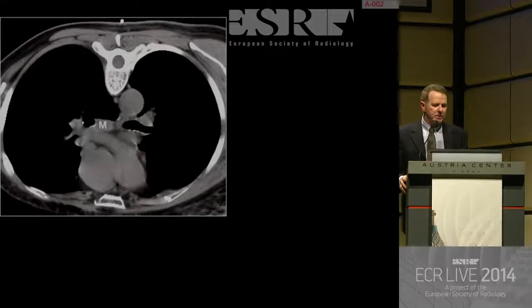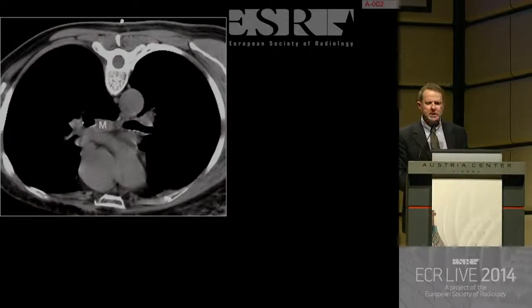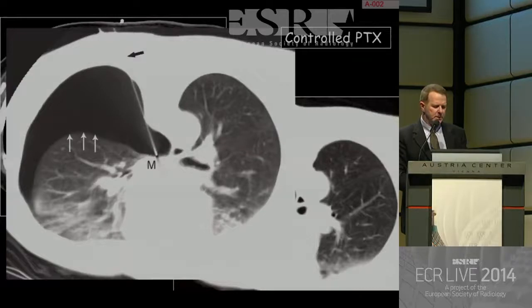When it gets very difficult, this raises the level of difficulty, but in any procedure, the more you do, the more confident you feel, the more you lower the threshold of your indication, and you raise the level of your expertise. This lymph node over there is not easily reachable. We induced a pneumothorax, the lung collapses, and you get to the node. I've heard somebody saying, who? Okay, it's not easy, but it's better to have a controlled pneumothorax, which you aspirate, rather than a real pneumothorax, which you have to drain. Because in an induced pneumothorax, there is no hole in the pleura. The air that you find in the pleural space is coming from outside, and as you have introduced it, you can aspirate it. Of course, CO2 is better than air.